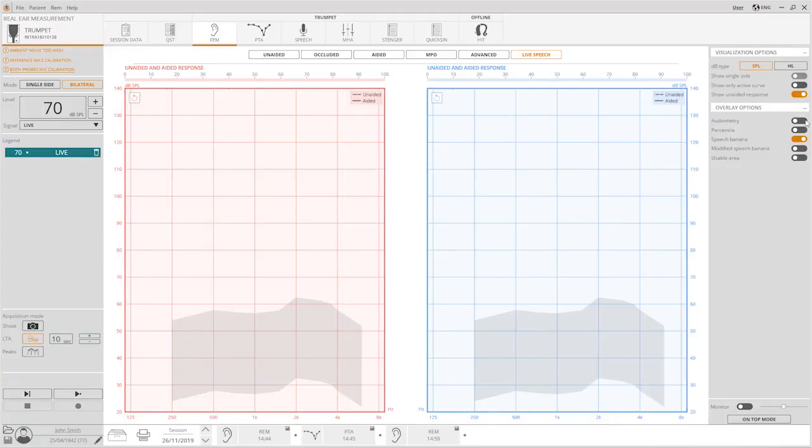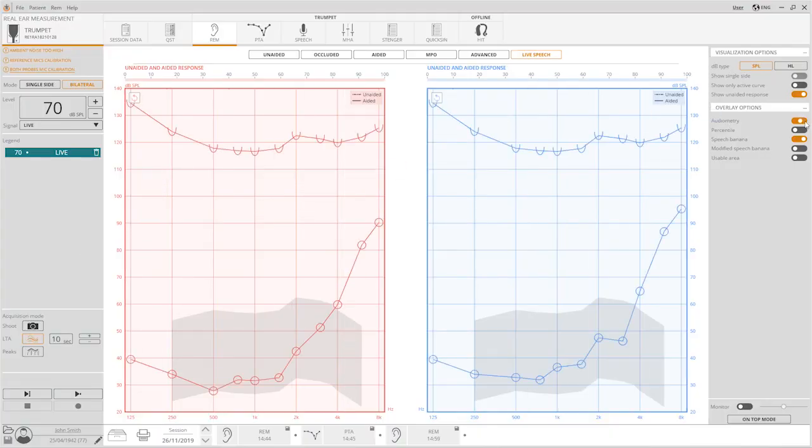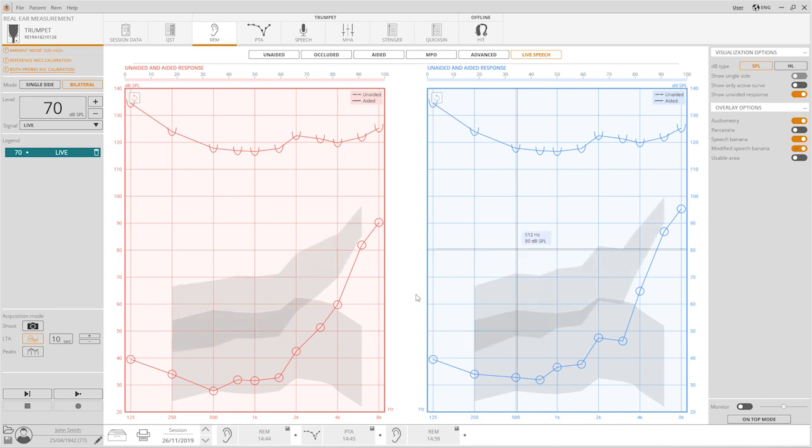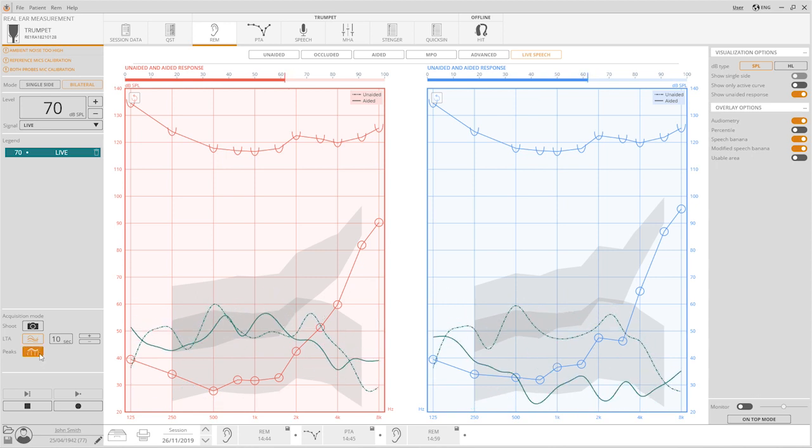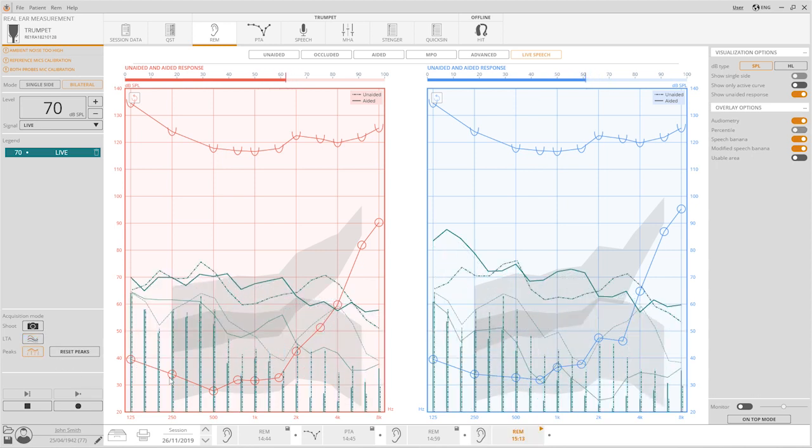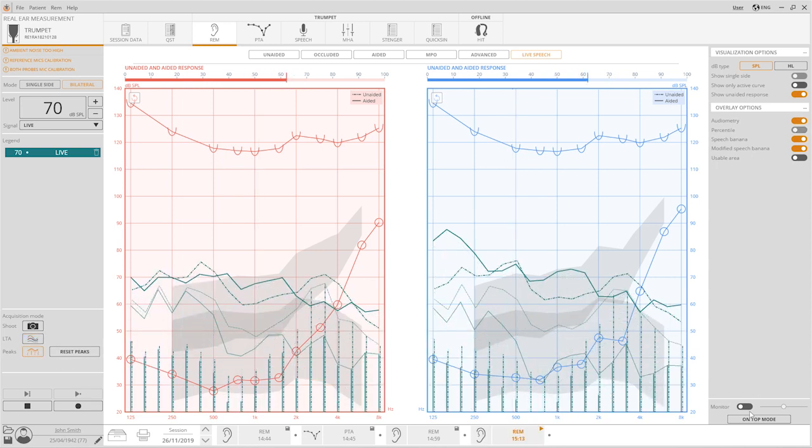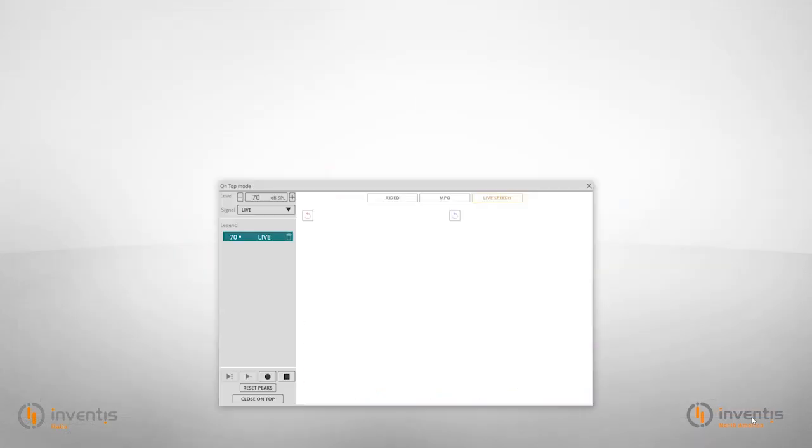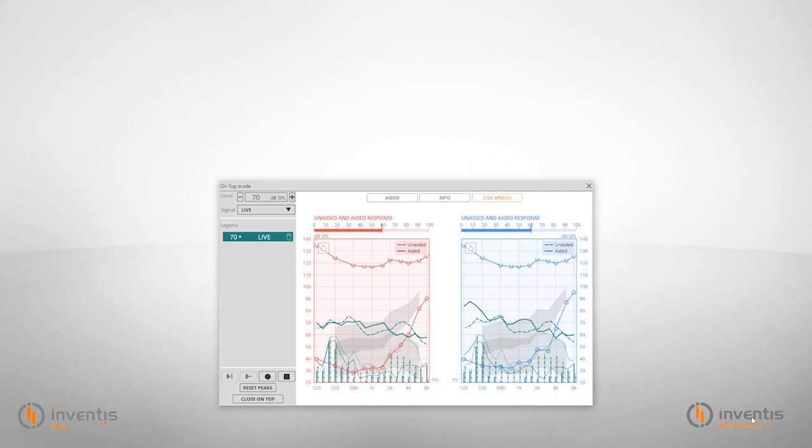From the visualization options, enable only the options audiometry and modified speech banana. Run the peaks acquisition mode and press the on top mode to reduce the size of the Maestro software screen.